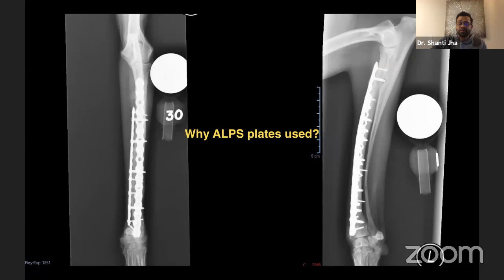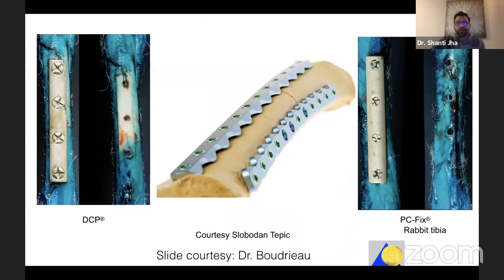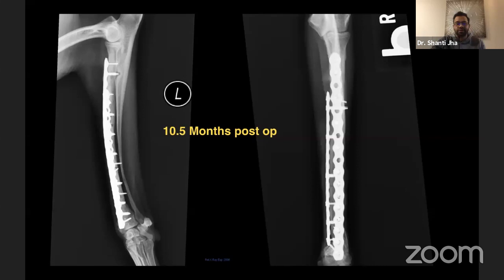And these plates are lighter, they're titanium, and that's how they look. They have only a tiny point of contact, and they're specifically sitting right up, I would say about a millimeter or half a millimeter on top of the periosteum. And the contact is only two sharp points right by the screws. This is how it looks. But anyhow, we don't have to wait here. So this is about 10, 12 months later, dog is doing well. That was one of the difficult cases of my career.